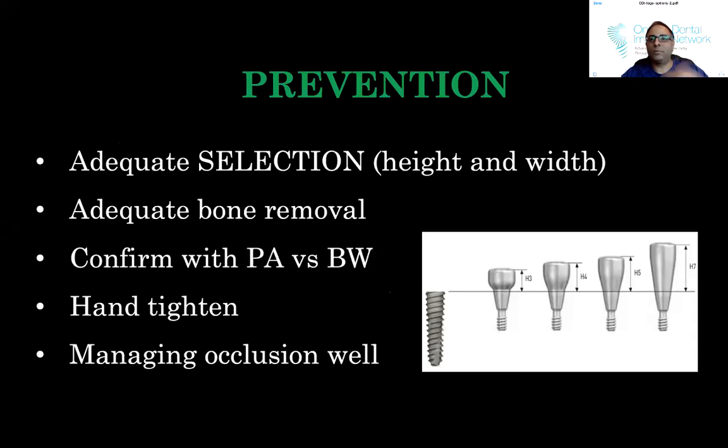Depends on what implant system you're using, but for Hiossen, you should be able to tell that. You can confirm it with a PA, but sometimes it's hard to see on a PA, so I'll even take a bite wing to ensure it's fully seated.